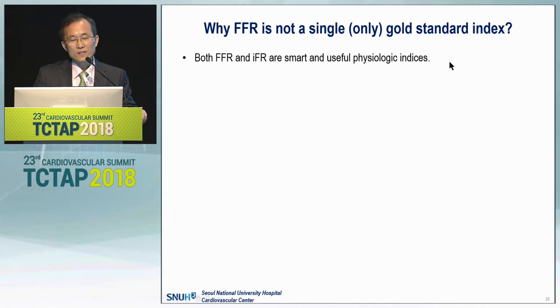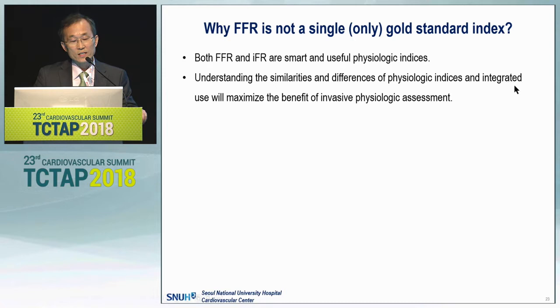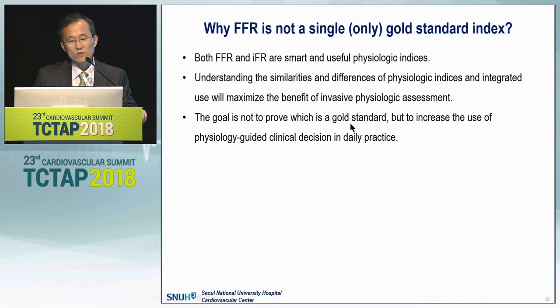I think both FFR and IFR are smart and useful physiologic indexes, and integrated use will maximize the benefit of invasive physiologic assessment. And the goal is not to prove which is good or gold standard, but to increase the use of physiologic guided clinical decision in daily practice. And my simple answer to this question is two is better than one.